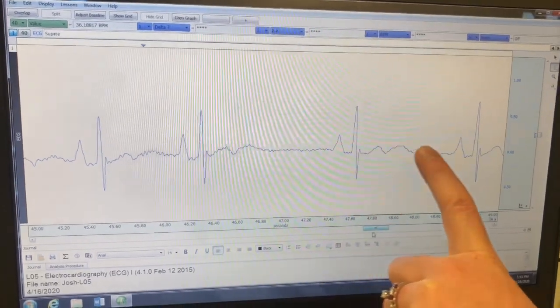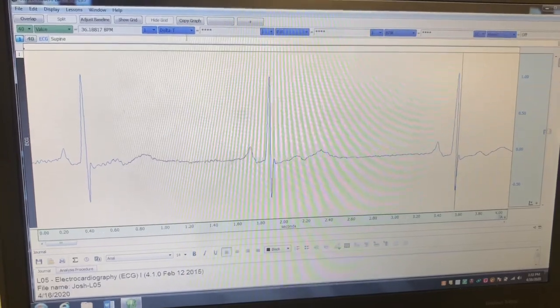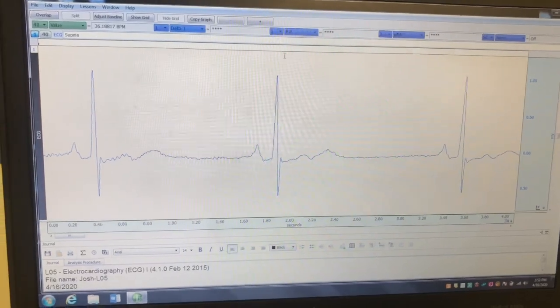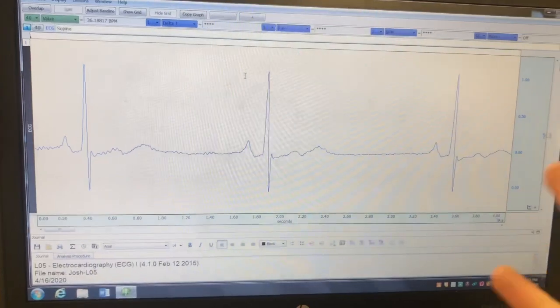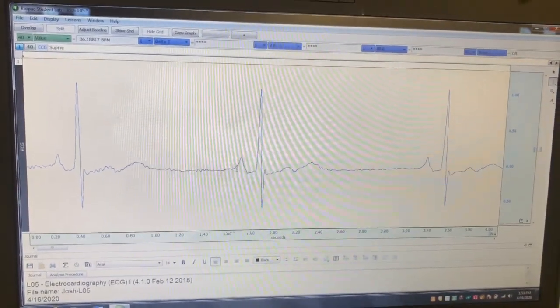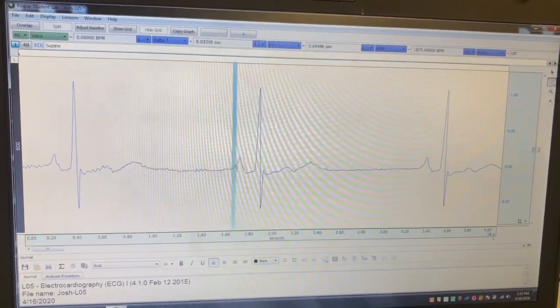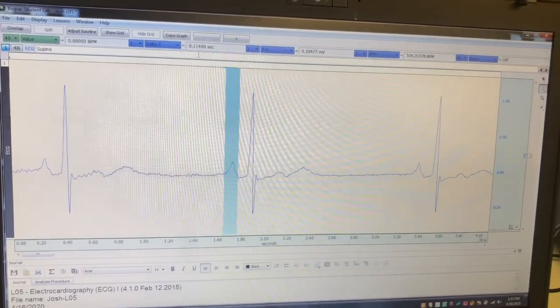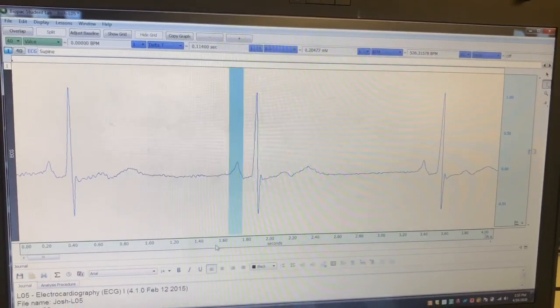When he was exhaling it was a little bit of a longer ECG. We're going to take the data from this — what you want is the time and the amplitude, right here, for each wave: the P wave, QRS wave, and T wave. I've blown up the ECG so it's a lot easier to see. You're going to take your cursor — this is your P wave right here — and go from the start of the P wave to the end of the P wave. You'll see time and amplitude, those are the two things you want, and you want to find three different P waves.